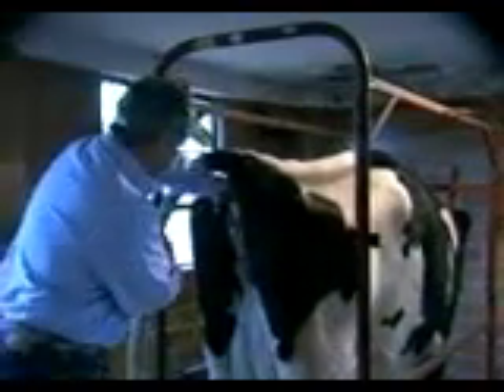To AI the animal, we lube up our hand and go in and clean the vulva area where we're going to insert the rod. The hand can then be placed into the rectum, and as will be shown here, by gently pulling back on the rectum as he inserts his hand, he can actually open up the vulva — opening the vulva — and then cleanly putting the rod into the vulva and into the vagina.